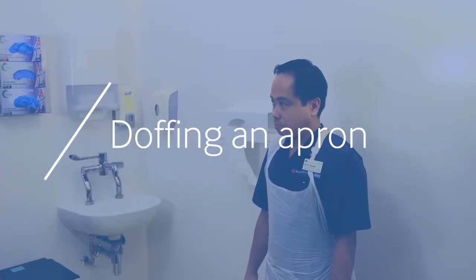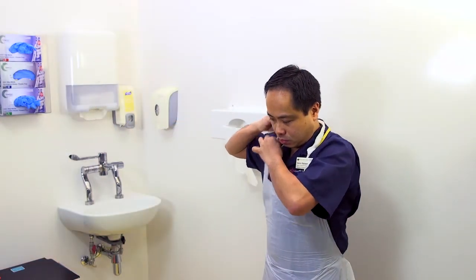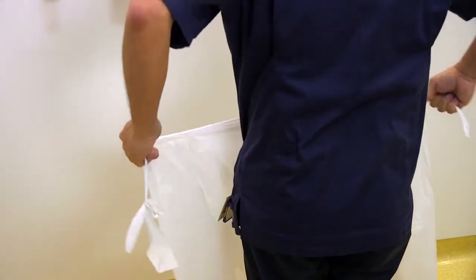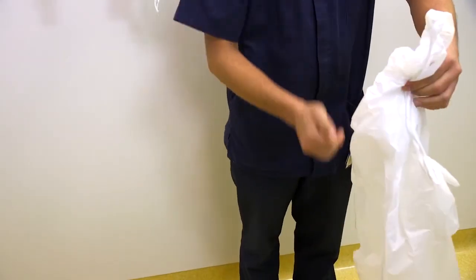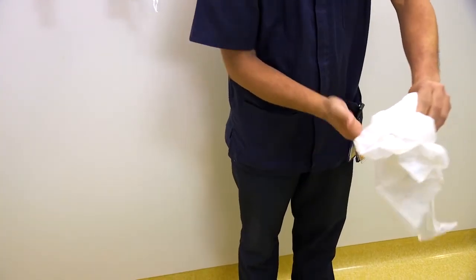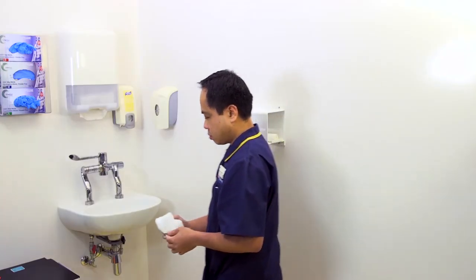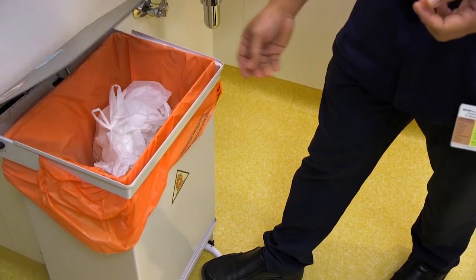Once aprons are used and are ready for removal, take off the neck strap by snapping and pulling forward and down. Break the waist tie, pull forward and fold all the outside surfaces inwards so all the contaminated areas are enclosed and there is no re-contamination of the wearer or the wearer's clothes. Discard into a waste bin.